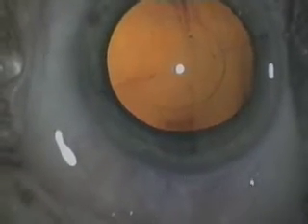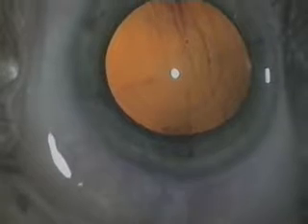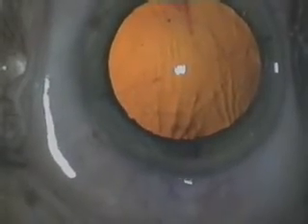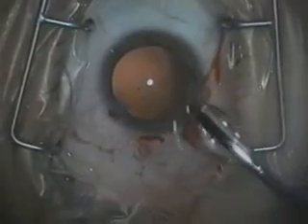After phacoemulsification, the anterior chamber and the capsular bag are filled with a viscoelastic solution to provide sufficient space for the implantation. Using special silicone implantation forceps, the microcyl toric is removed from the container and folded in one simple step.